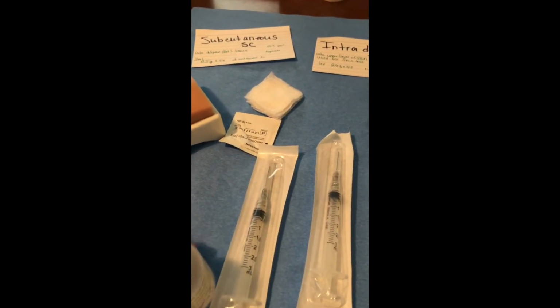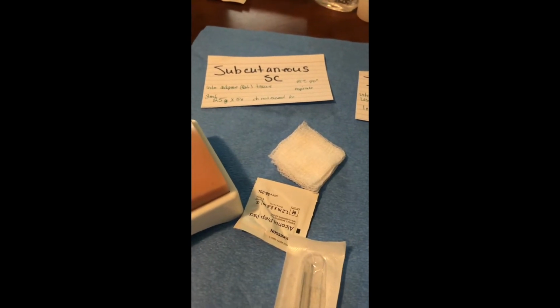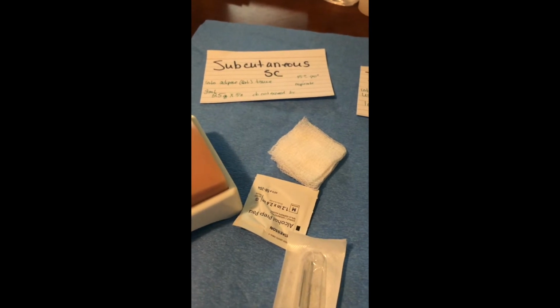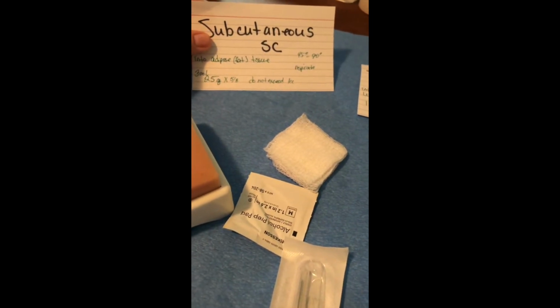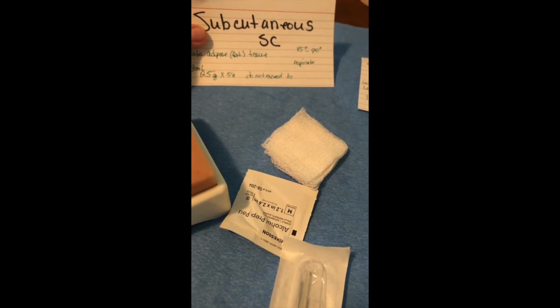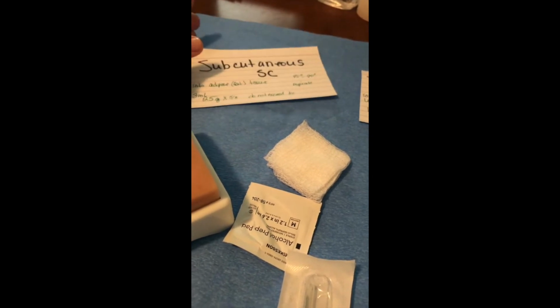So for the first part, I'm going to talk about subcutaneous injections. Subcutaneous is going into the fat part of the skin. Most commonly as a medical assistant, with this injection, you're going to do allergy injections, okay? It can go anywhere from a 45-degree angle, which is normally what we're going to do, and this is what I'm going to teach you.